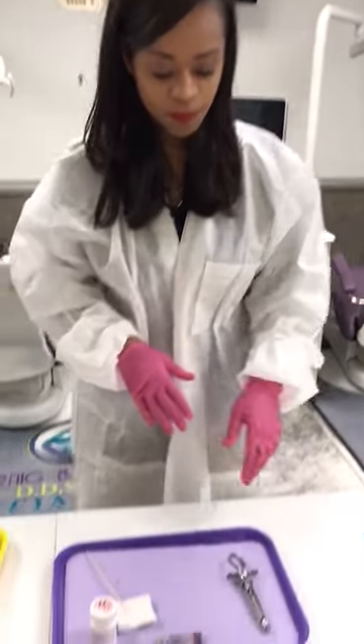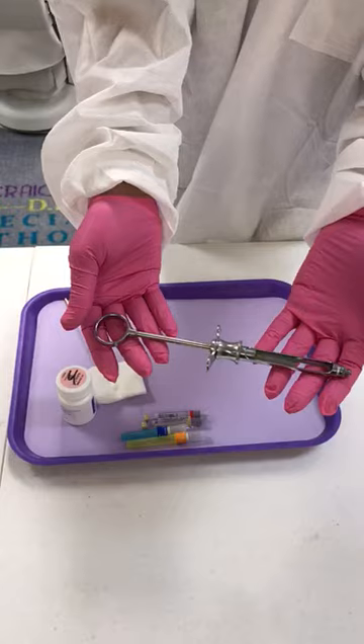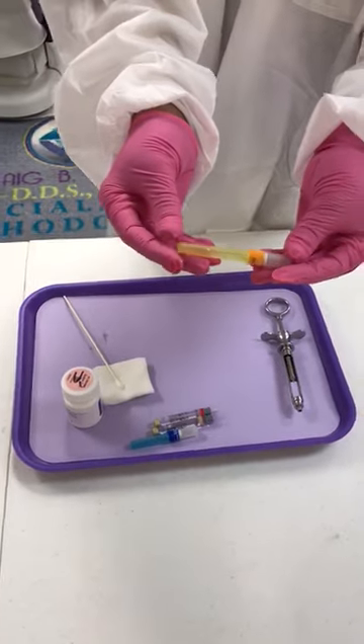This tutorial is going to be on how to set up an anesthetic syringe. This is an anesthetic syringe. This here is a long needle — they usually come in yellow. These are used when you are numbing up posterior teeth.